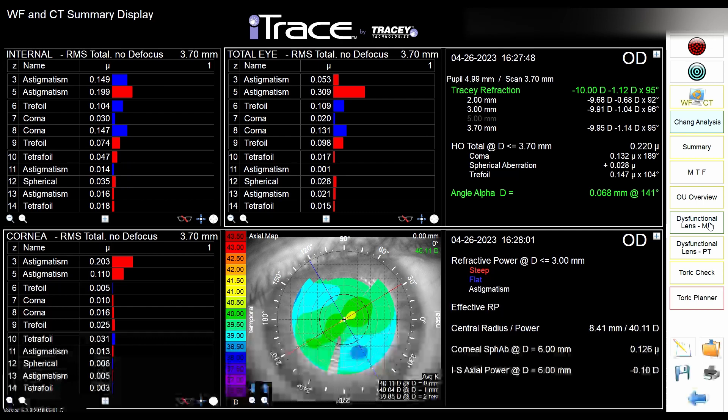Based on this display, you can see whether the patient is a good candidate for lens exchange or whether they should have laser refractive procedures. You don't have pachymetry here, but this is still very useful. If you're trained and spend a lot of time on this machine, you can tell what kind of surgery the patient is a good candidate for.